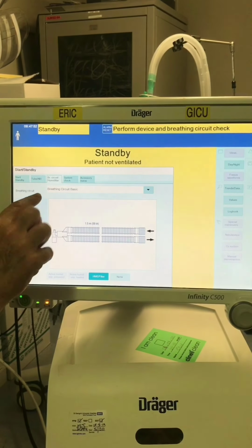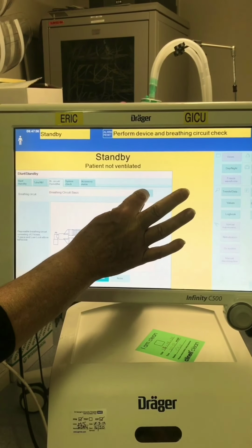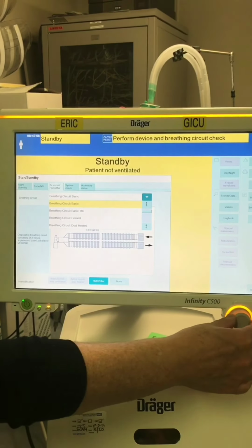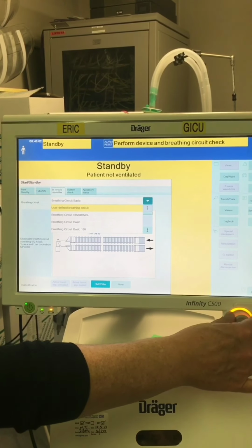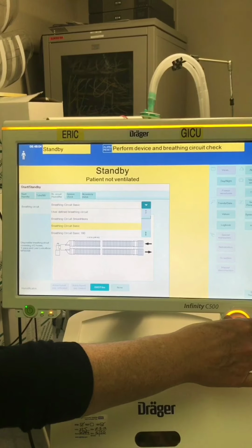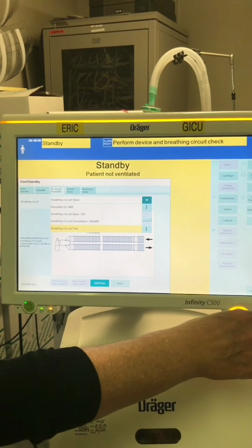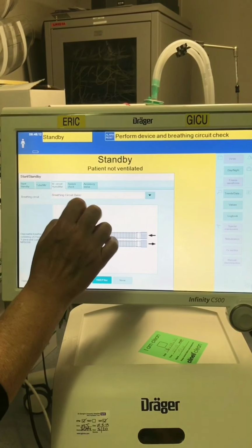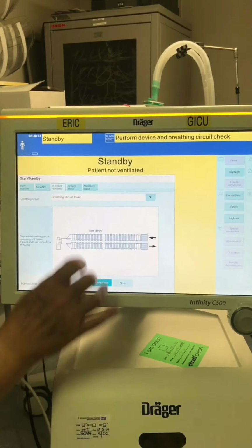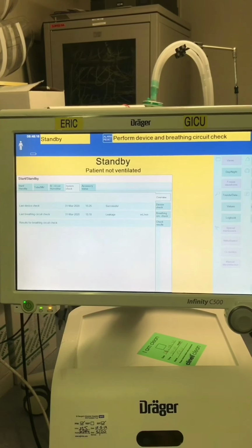I need to make sure that this is on a breathing circuit basic. If it isn't, you can use the arrow button here and use the control knob to scroll until you get to breathing circuit basic. I'm not changing it. And then the next one is the system check, which is the pre-op check on this.